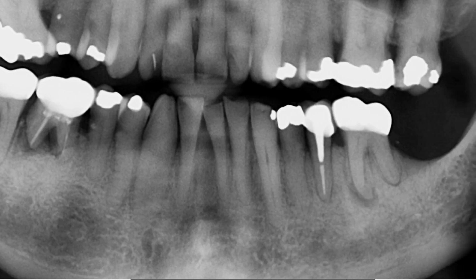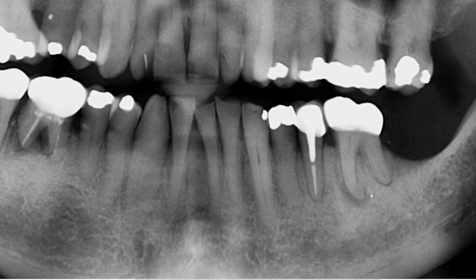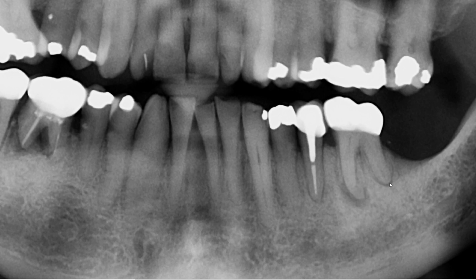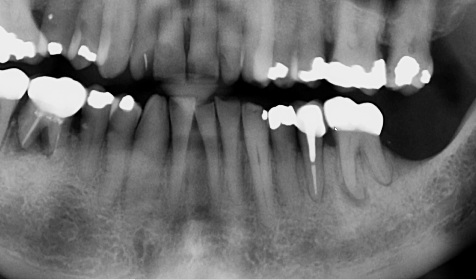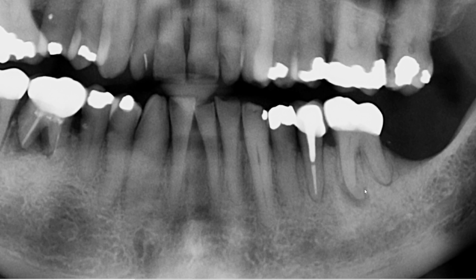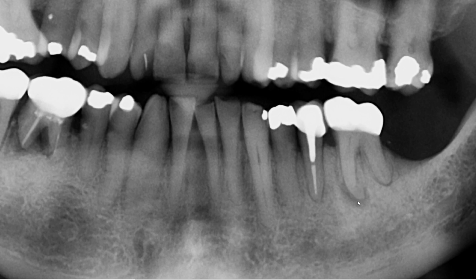Let's go over to the other side. In this case, although we haven't had any major resorption, do you see that there's a periapical radiolucency? Looking at the distal root, the PDL space appears slightly widened, and this one for sure has periapical radiolucency. This tooth has a large coronal restoration. I would definitely recommend the clinician to percuss the tooth and do vitality testing if possible. I would presume that given the radiolucency, there's active inflammation occurring here, and the patient would respond sensitively to percussion as there may be inflammation involving the PDL space.